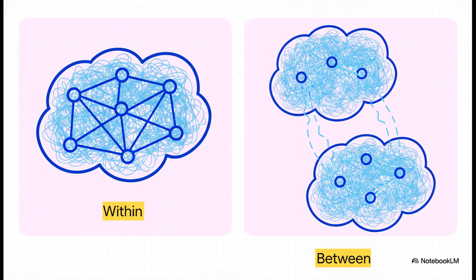First, the within ROI correlation, which is the mean of all pairwise correlations among channels grouped in the same predefined ROI. And second, the between ROI correlation, meaning the mean of correlations across channels in completely different predefined ROIs. The scientific logic here is rock solid. If the theory is right, and these ROIs are internally coherent, then channels inside the same ROI should correlate much more strongly with each other than with channels outside that boundary.